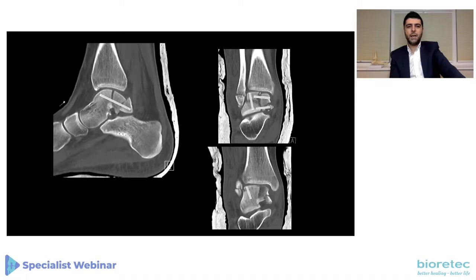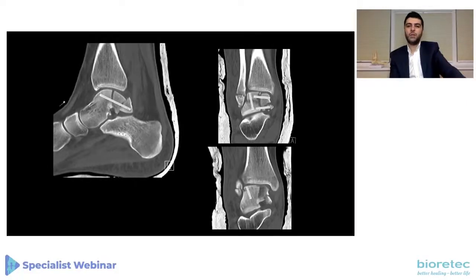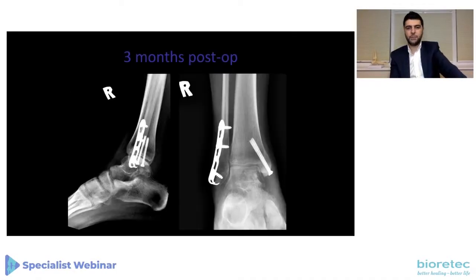In terms of the Activa nail placement, it depends on the fracture pattern, of course. And this is a rough approximation of where they went. I used 4 or 5, I think, of the ActivaNails. And it's important to try and put them perpendicular to the surface because of the slightly prominent head as opposed to the pins. So this is a rough approximation, and they come in different lengths, of course.